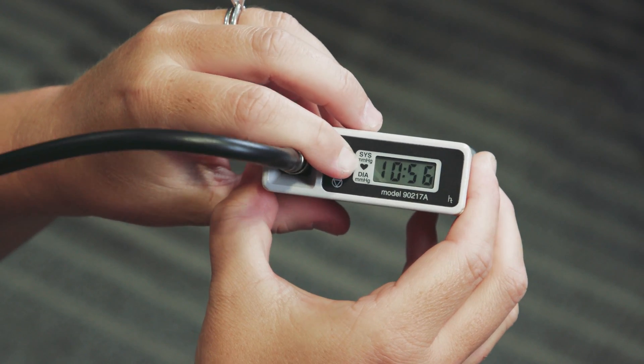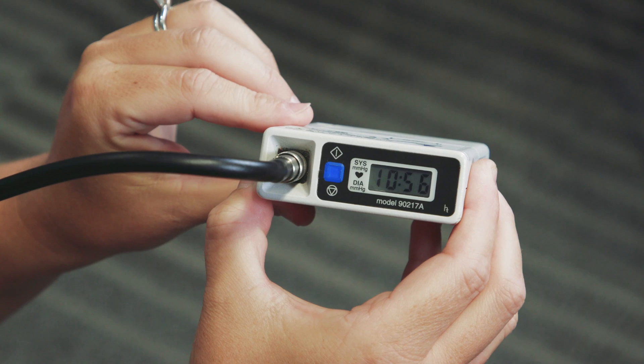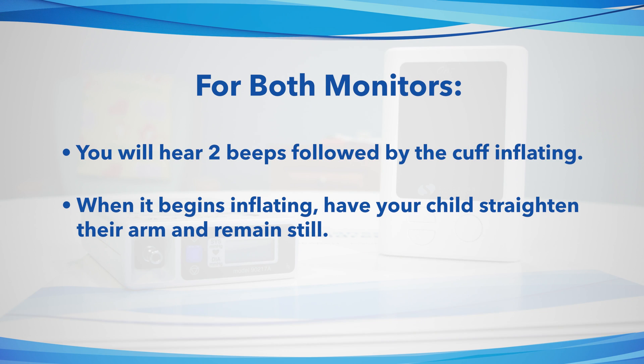For both monitors, you will hear two beeps followed by the cuff inflating. When it begins inflating, have your child straighten their arm and remain still.